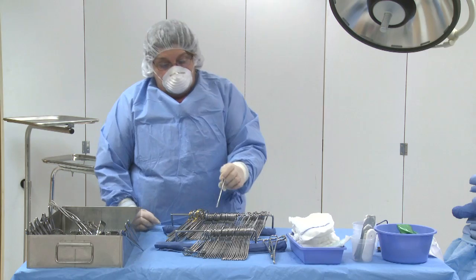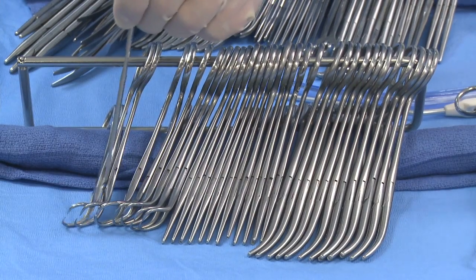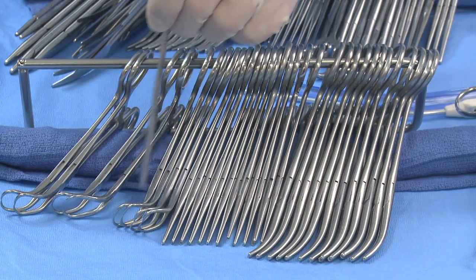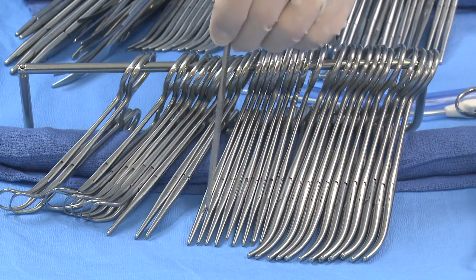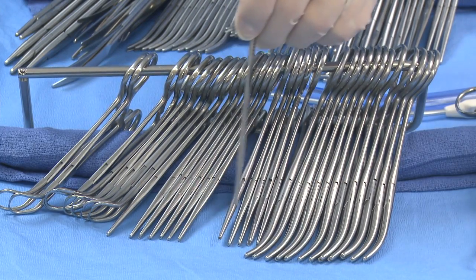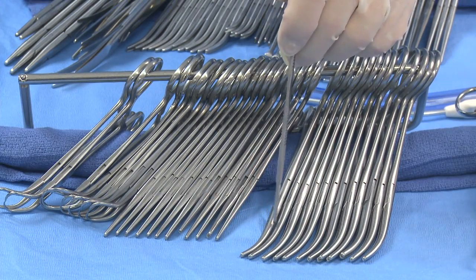Now we're going to go to the short string and start with the towel clips: 1, 2, 3, 4, 5, 6, 7, 8 towel clips. Then 1, 2, 3, 4, 5, 6, 7, 8, 9, 10, 11, 12 straight snaps.